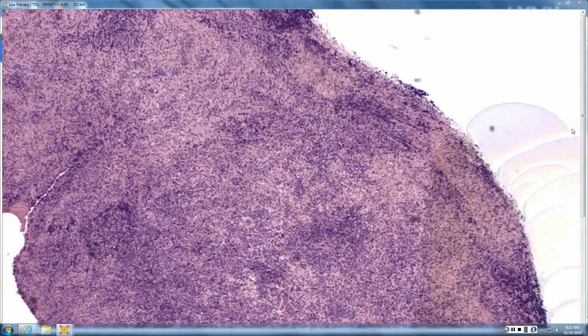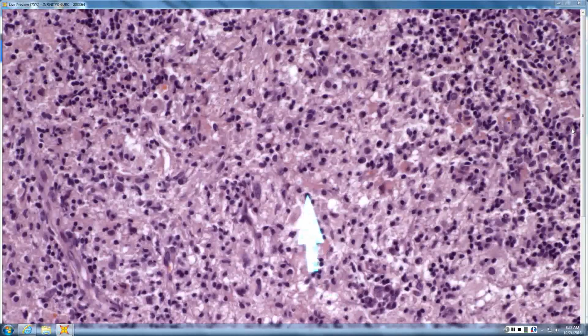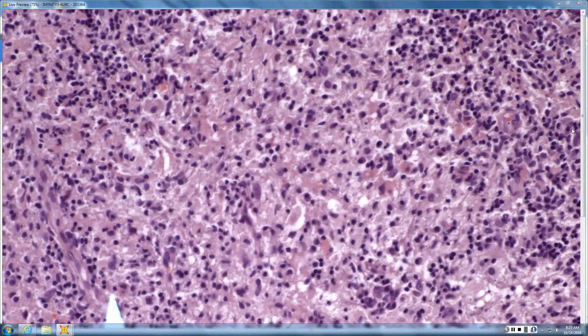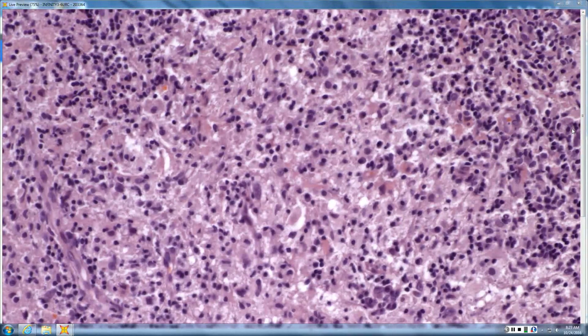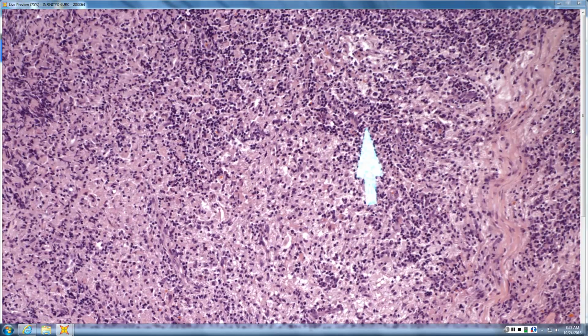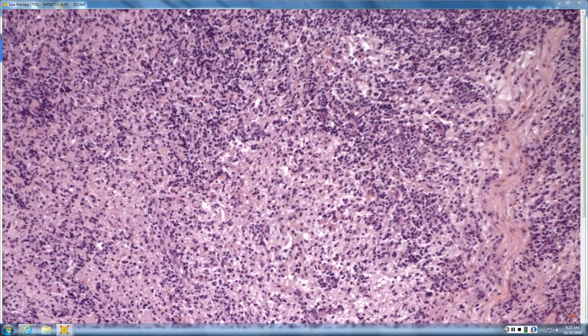Okay, how about here? So we have a pretty good diffuse infiltrate of lymphocytes with little lymphoid aggregates. We also have some trapping collagen. Got some granulomas in there as well. Have a lot of foam cells potentially. They seem kind of bubbly, and plasma cells. And any of those plasma cells pyknotic? Maybe. I don't see any, really. So I have sheets of histiocytes, question of whether it's foamy or just granular cytoplasm, but I definitely have lymphoid aggregates, and I have plasma cells superimposed on those histiocytes.